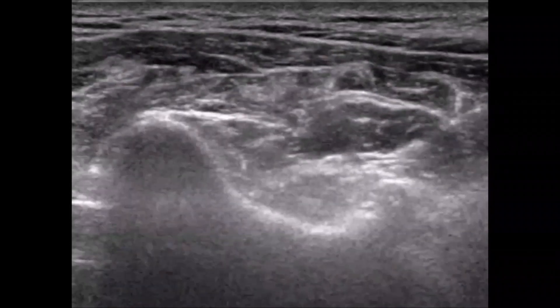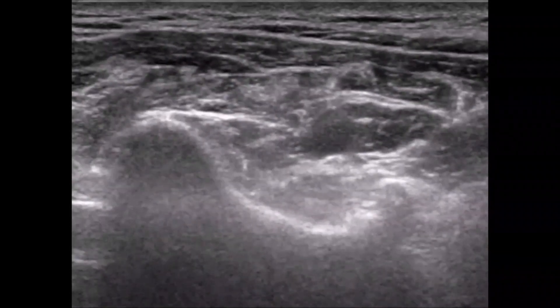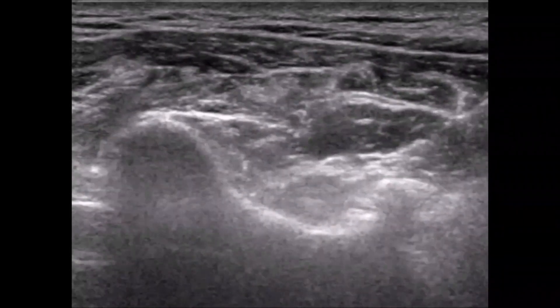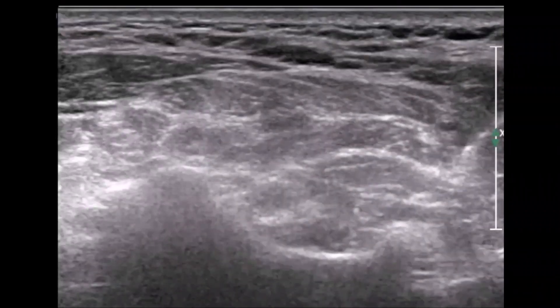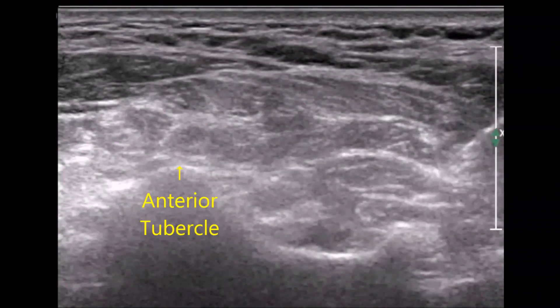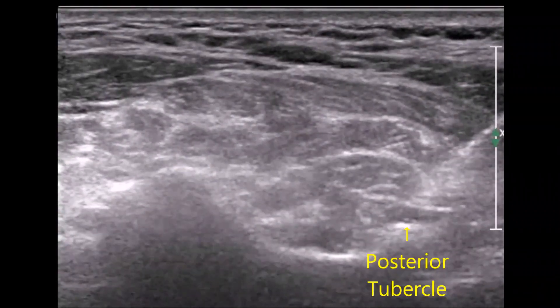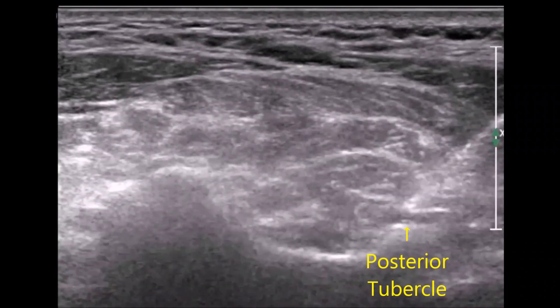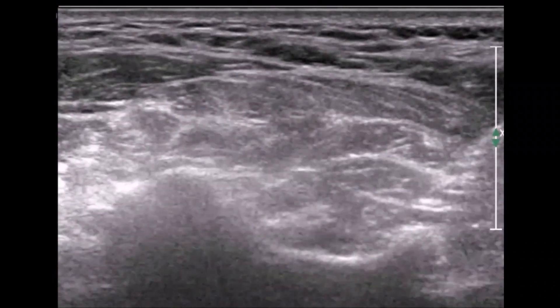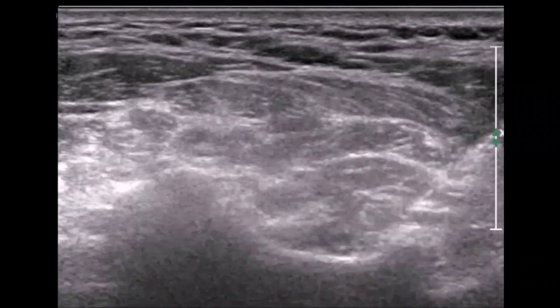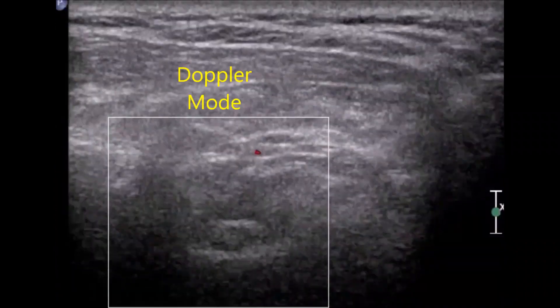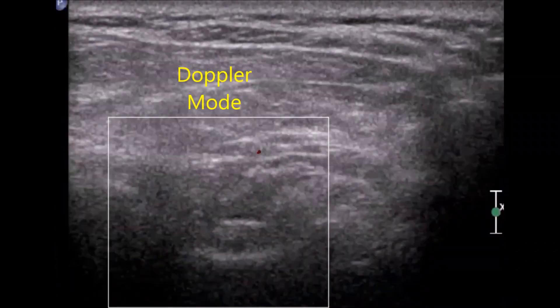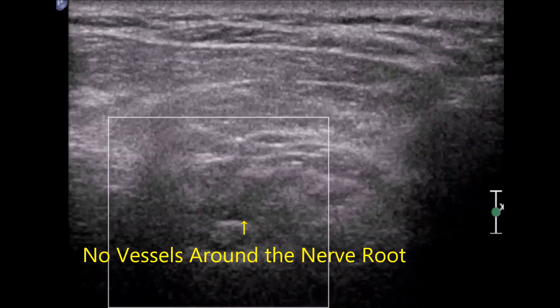This completes the video demonstration of the cervical spine ultrasound-guided selective nerve root block to the fifth nerve root level. Here is another video clip example showing more clearly the location of the needle tip. The Doppler mode can provide evidence that there are no vessels around the nerve root for safe injection.